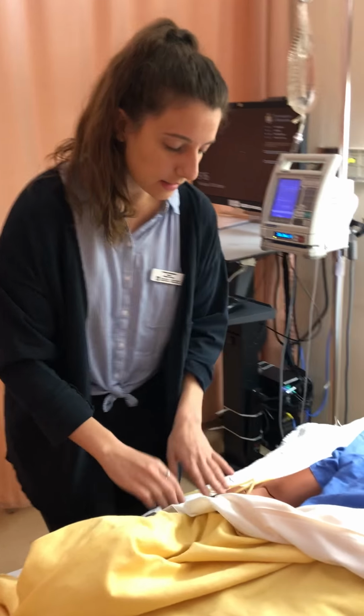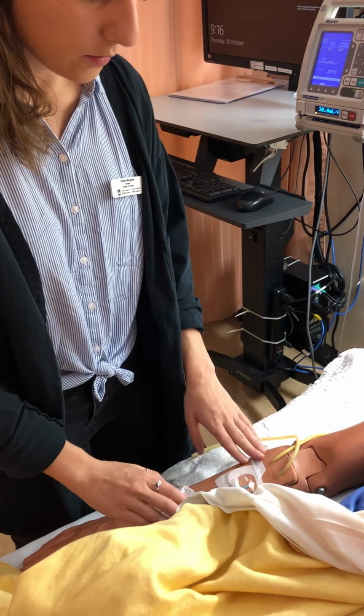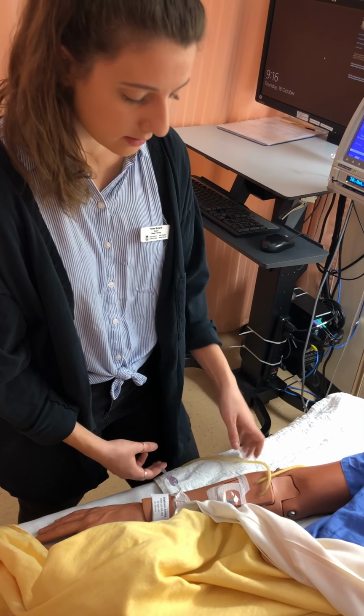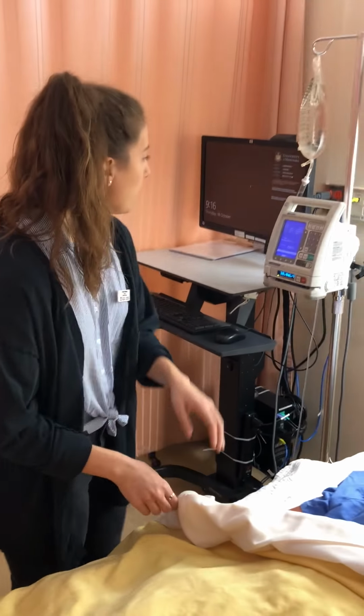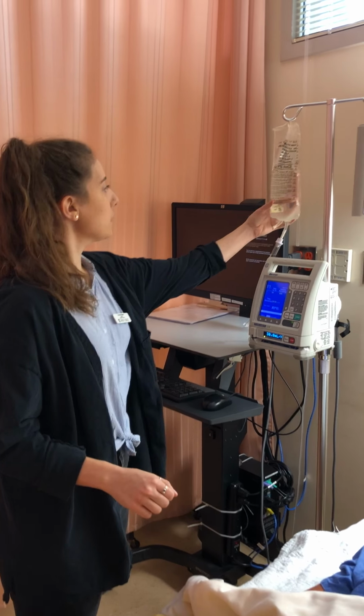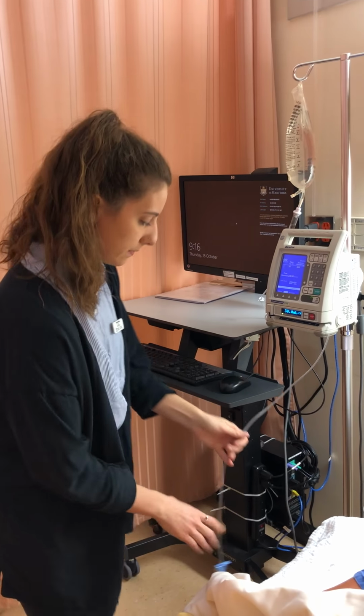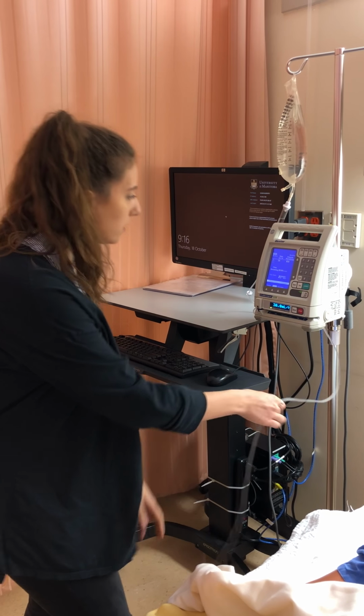So I'm just going to check the site here. Is there any pain? No pain. Okay, there's no redness, no swelling. It looks good. It's patent, so I can go ahead and give the drug. My primary is running here. The bag looks good. It's running at 30 milliliters an hour. Tubing looks good.